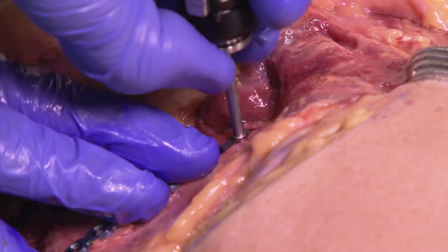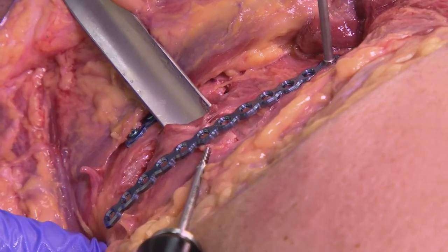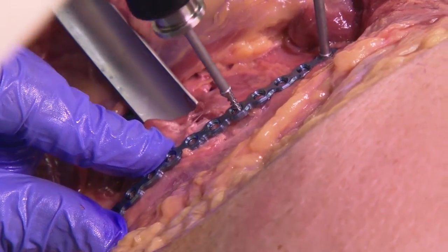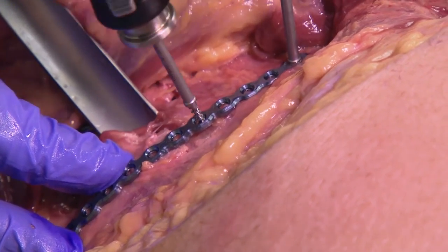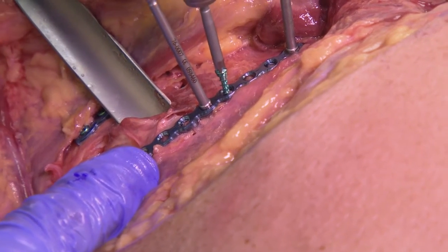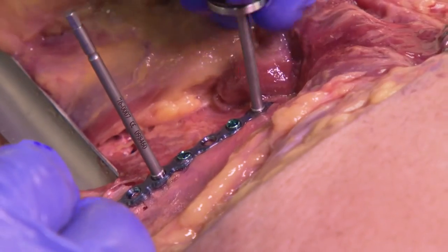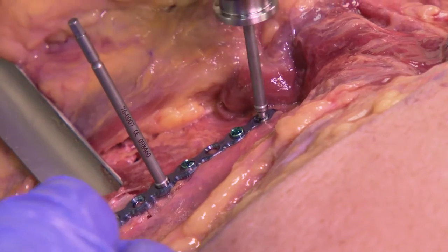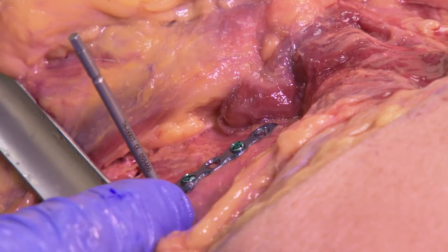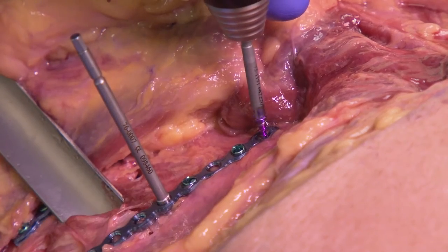Once the temporary screw is fully seated, take off the screwdriver handle without over-advancing to minimize stripping. If the plate is still off the bone, another temporary screw can be used to bring it down to bone, or alternatively a clamp can be applied. Being happy with the anterior aspect, several screws are placed. The temporary screw is then removed and a final screw placed into that hole. The remaining temporary screw is maintained in position to help hold our reduction and minimize stress on the screws already in place until the final construct is finished.